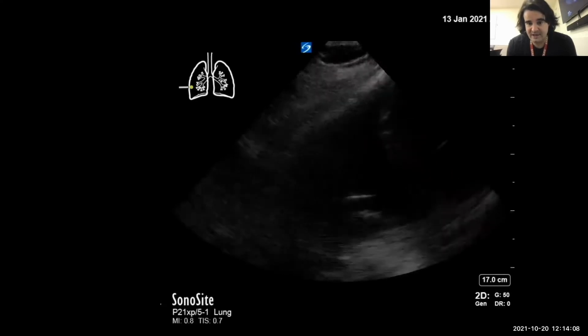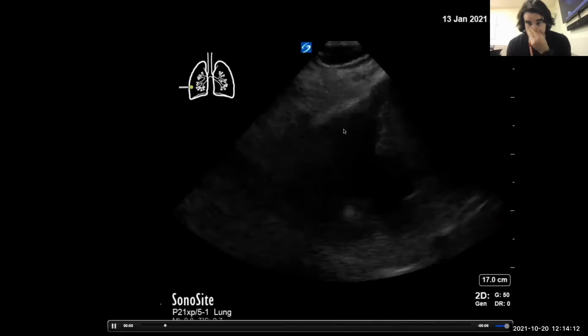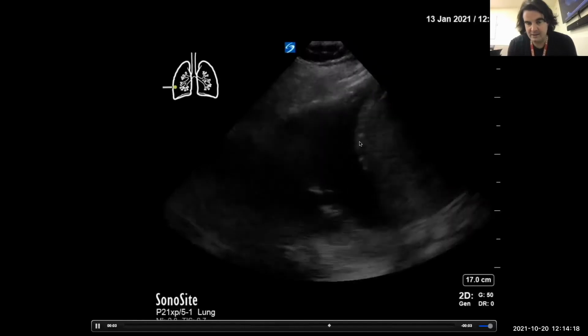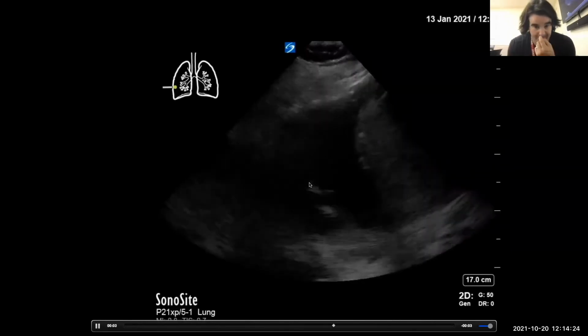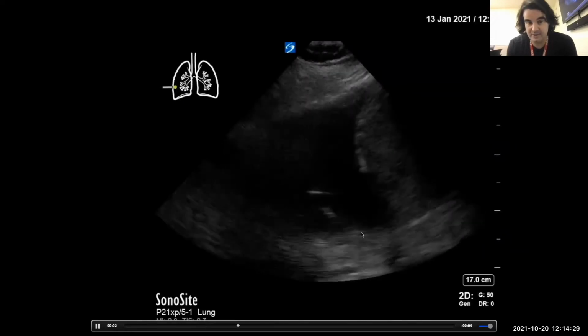Another image essentially the same, but again, spine. We definitely know for sure that this is fluid. Okay, this is a little more clear here. You can see the diaphragm quite clearly, and fairly large. This is kind of the pleural space margins here. Chest wall, that's lung, diaphragm, and spine itself, okay?